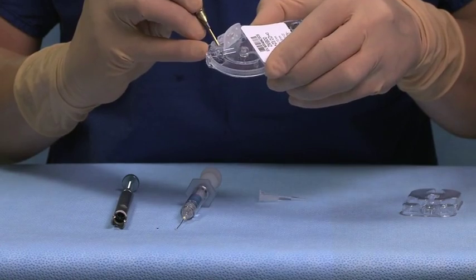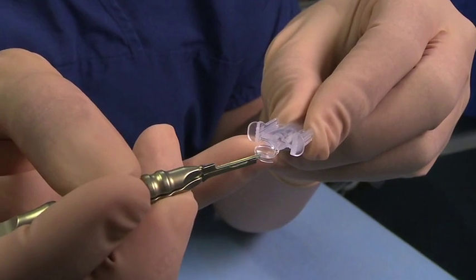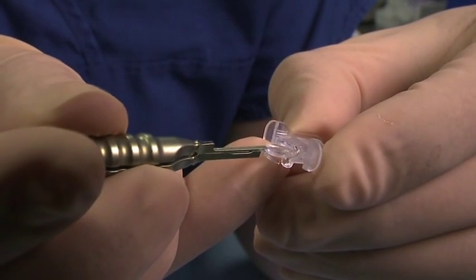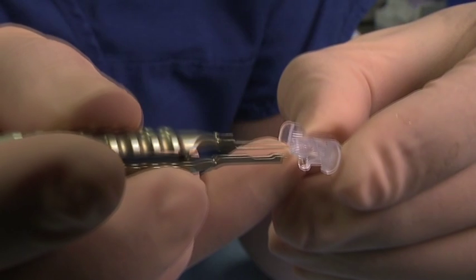Grasp the lens with your forceps by the optic edge only and hold the cartridge with the IOL diagram facing up. Engage the lead haptic with the canopy and sweep the lead haptic over the optic body in one motion, leaving half the optic inside the cartridge.